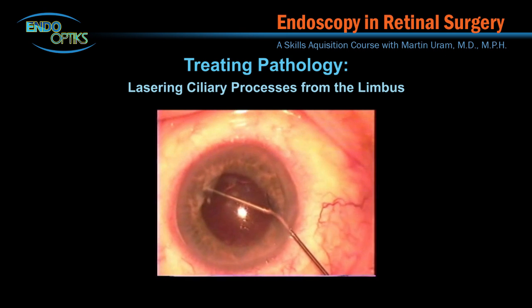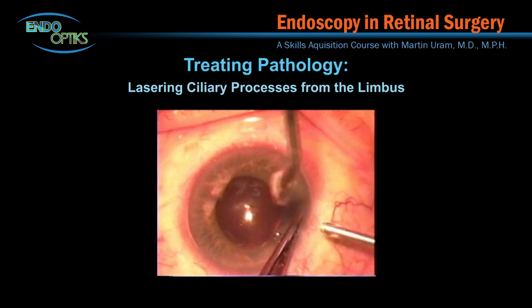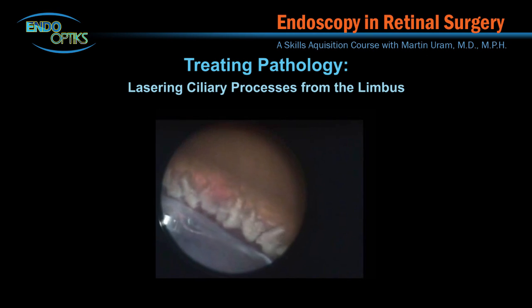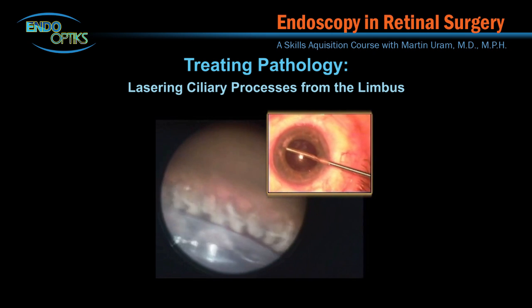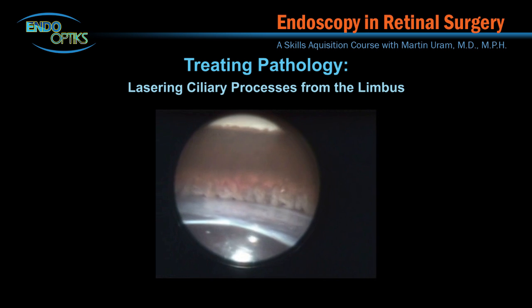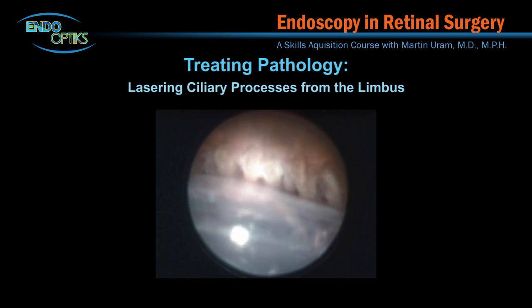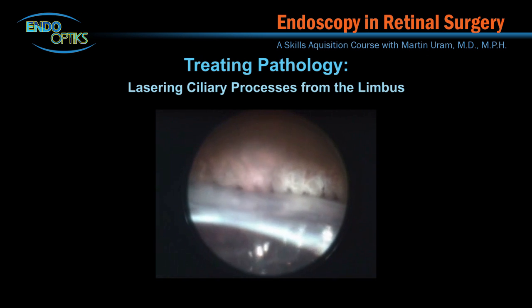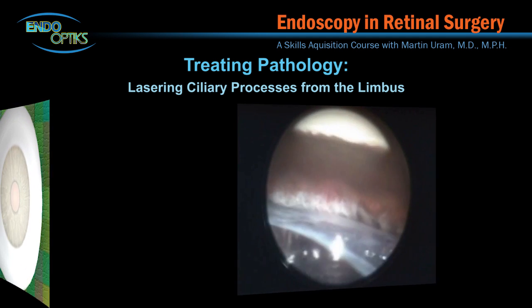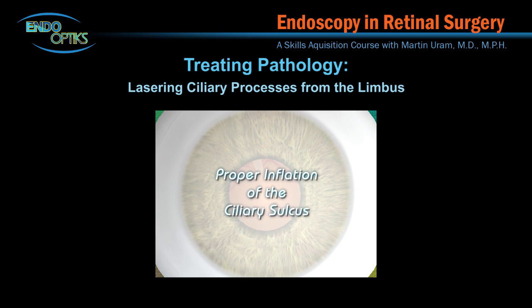Indeed, there are many uncontrolled glaucoma patients who have failed or are unwilling to undergo a trabeculectomy or tube implant due to the limitations of efficacy and potential complications. ECP is a different matter. It is very safe, can be highly effective, and is rapidly performed. It requires a minimum of postoperative care compared to these other approaches.